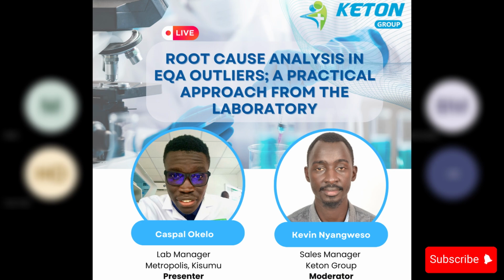Then you'll definitely review calibration and reagent history. You compare peer groups in your EQA. Then you do your corrective and preventive action. So the danger, especially in hematology, is thinking that if QC is within range, we are fine. But you realize that if there's a shift from maybe 15 grams per dL in HB to 15.8, it might still be within limits, but it's a bias. And most of the time, EQA will detect it. So you, as a strong laboratory, need to detect it before EQA does.